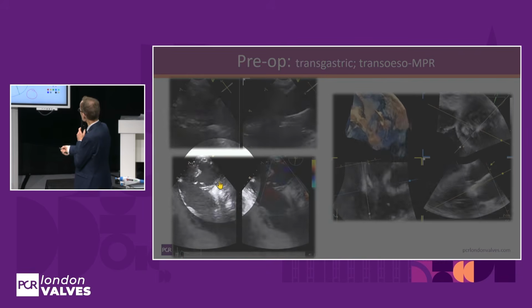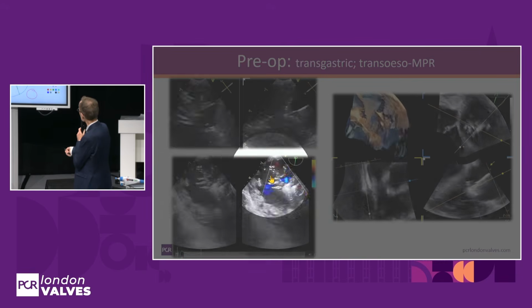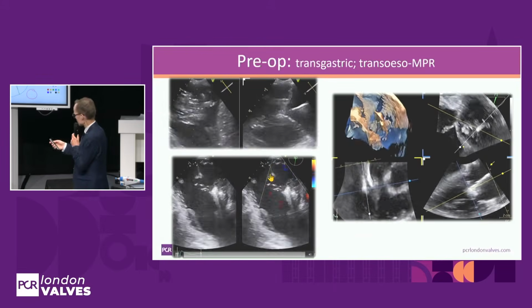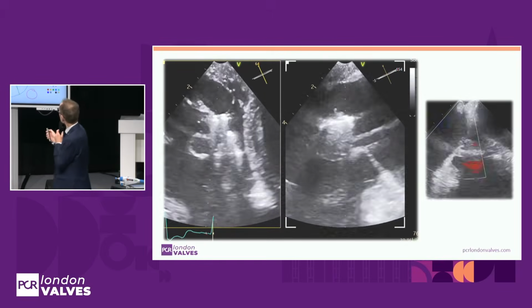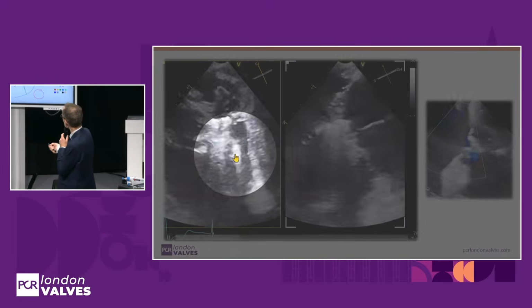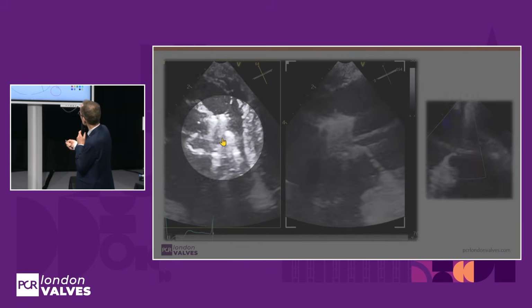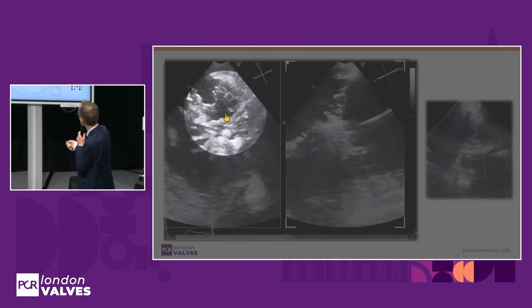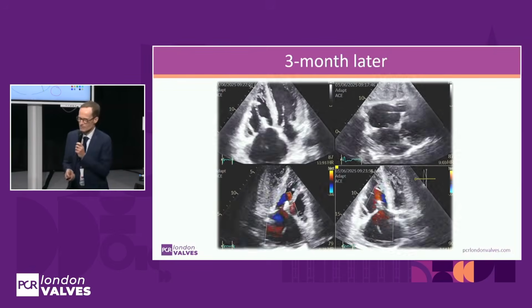We were quite successful with the septal leaflet, with the anterior leaflet, but as you can see, there is still some degree of regurgitation. And then we decided to move on to implant a second clip. And as you can see, after that, we have the lead that is in the commissure between the septal and the anterior leaflet. We have the first clip in that location. We have a second clip between the posterior leaflet and the septal leaflet. And the result at the end is perfect.